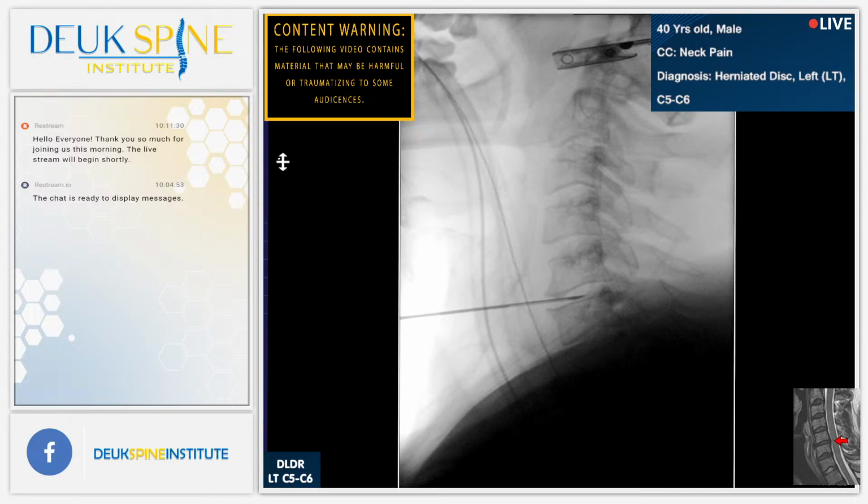Let's count our bones on our lateral, Henry. 2, 3, 4, 5, 6. Now, he had a car accident years ago, right? You can see he had a fracture of C3. Show us C3. You guys see how compressed it is? Show us the top to bottom. There it is. See the height there, top to bottom? It is smaller than it should be. So it was fractured. All right, let's get our discogram done.